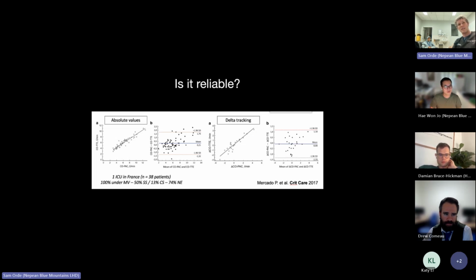Bland-Altman plots show differences of pretty close to plus or minus 1 liter, and that's certainly better than pulmonary artery catheters versus other things. So it's not too bad. It's only in 38 patients, but they were septic shock and cardiogenic shock, most of them on catecholamines, on noradrenaline. So I don't think it's too bad. I think we can say it's got pretty good precision compared to pulmonary artery catheters.